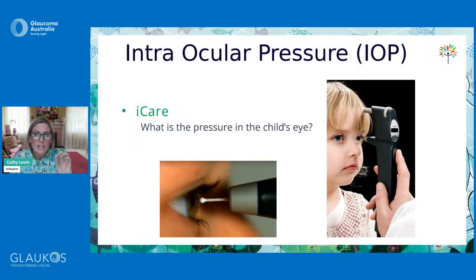We can't take the visual field test under an anaesthetic, but otherwise we can perform a lot of tests. But ideally, we'd like to avoid an anaesthetic if possible. So let's look at some strategies which might help with this.